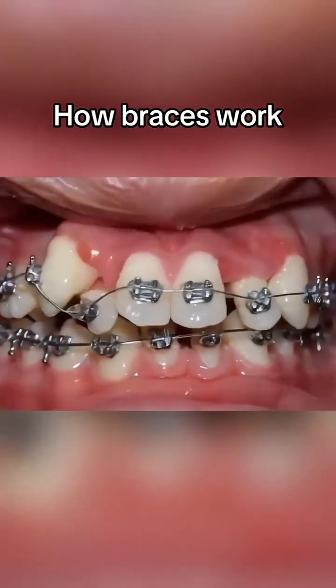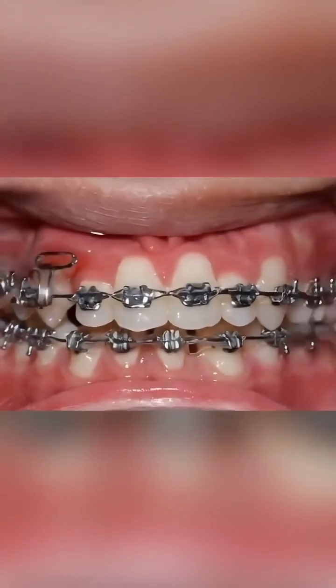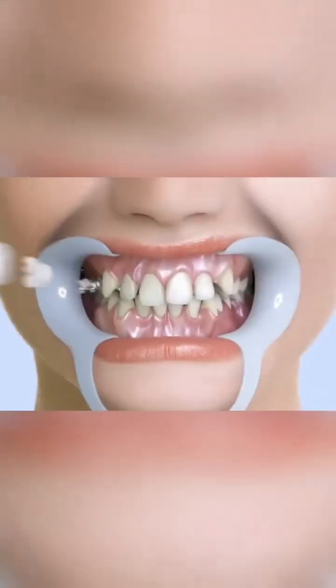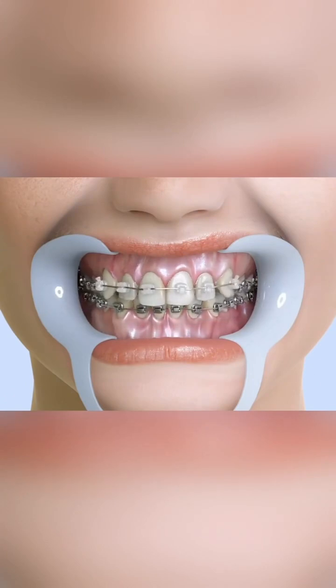The person who invented braces was truly a genius. So how exactly do braces gradually straighten teeth step by step? First, a custom set of metal braces is made just for you. Once the metal braces are fitted, the teeth straightening process officially begins.